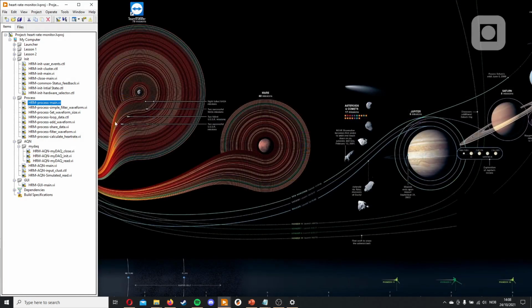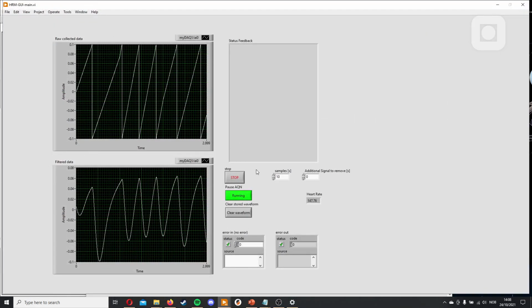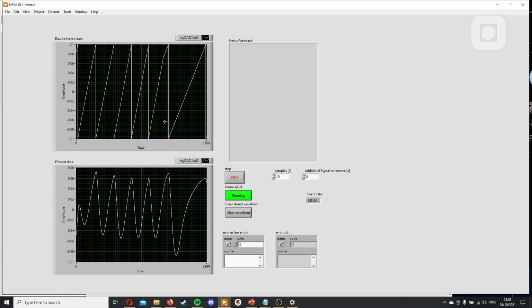We can now test this functionality by running the application. So we have our waveform. We see it's slowly but steadily growing, and we clear it, and it's deleted.